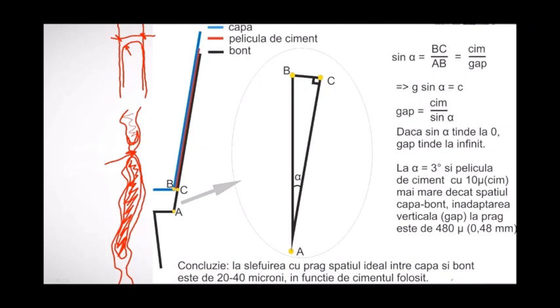And technicians often know that for some dentists, they have to leave more space. For other dentists, they can leave less space. So if we do shoulder preparation, we should have free access of the crowns until they touch down.